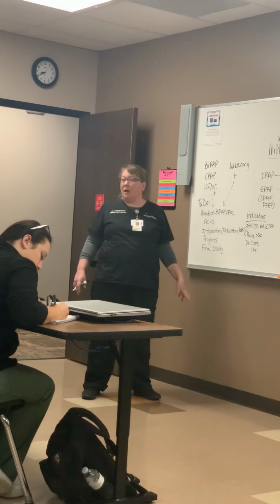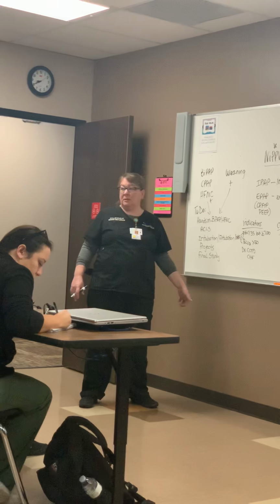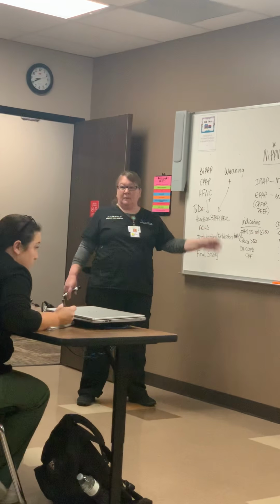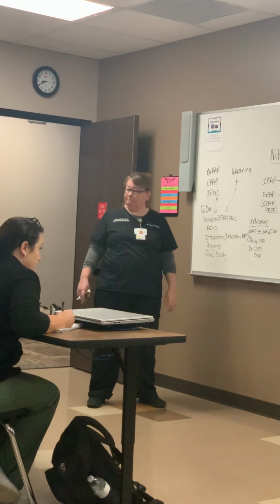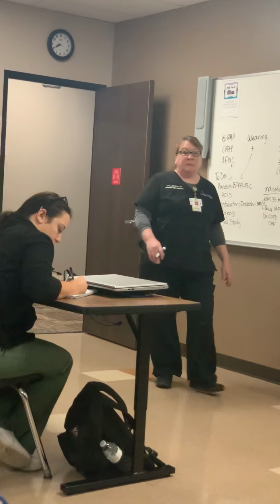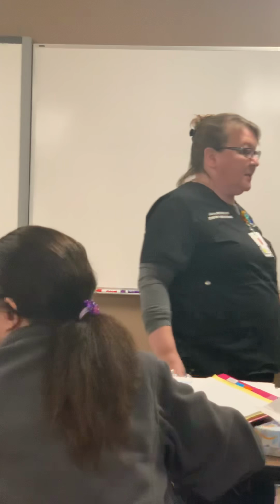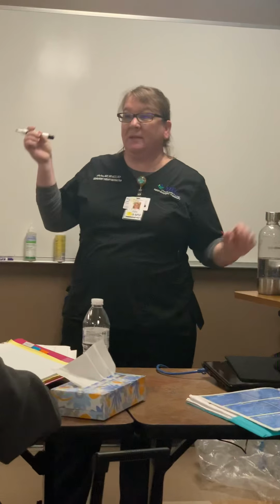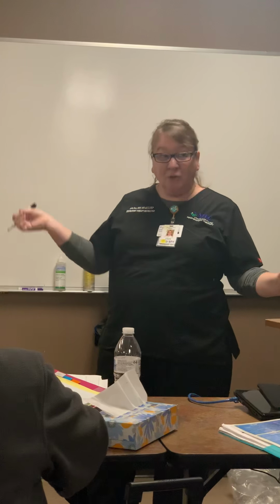You will see doctors that want to restrain a patient and put them on BiPAP and leave them in their room by themselves. Don't be part of it. Tell them that you refuse to do it. I have a recent grad who had to do it. I'm very serious when I say that. You tell the doctor that you won't do it. There are going to be times when the doctor's going to tell you to do something that's inappropriate. This is one of them. And they will try to do it. And you will tell them no.